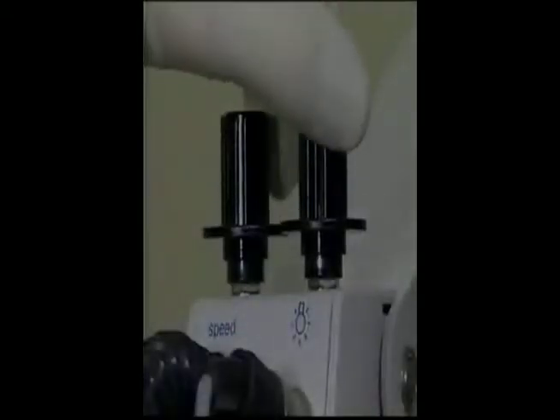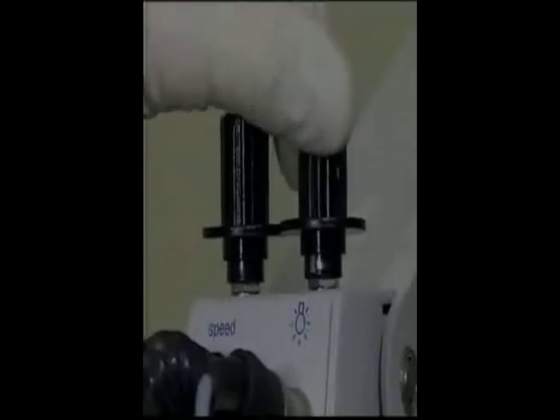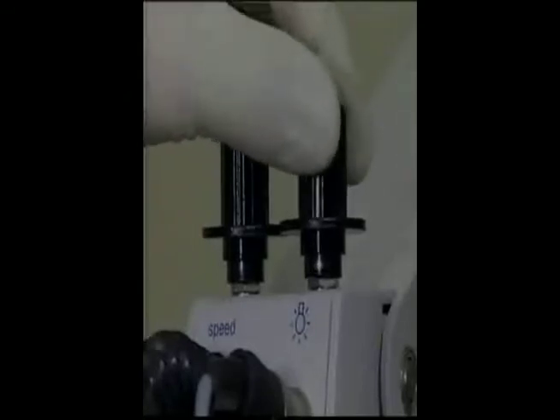The built-in halogen light source is simple to maintain. There's always a fresh spare bulb ready to be put into service at the flip of a knob. The degree of brightness can be adjusted to deliver just the right comfortable intensity to the operating area, thus reducing eye strain and fatigue during lengthy procedures.